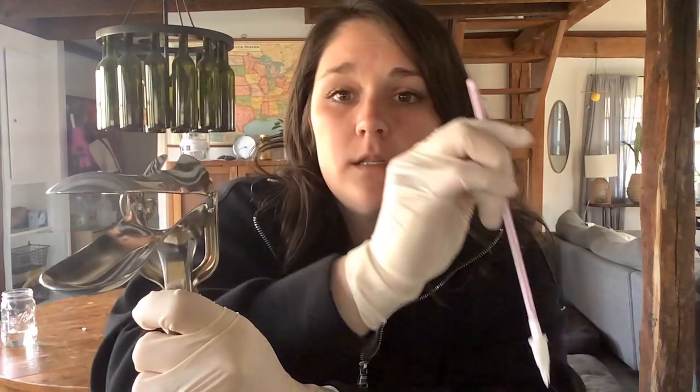So I'm inserting that into the cervix and then I'm twisting 1, 2, 3, 4, 5. And then I'm removing that and I'm putting this directly into my cup. That has the cells on it from the cervix that will test for any cancerous cells or any concerns.